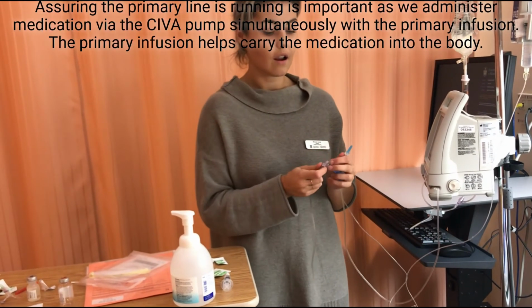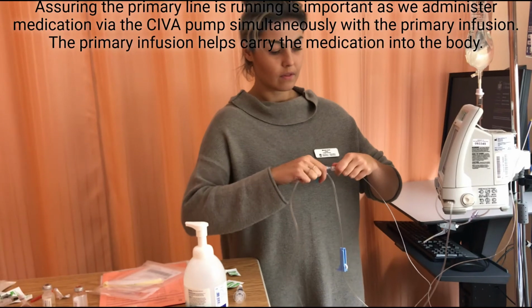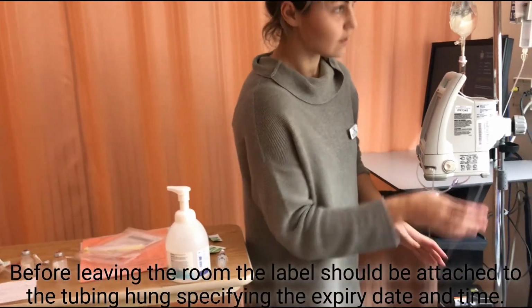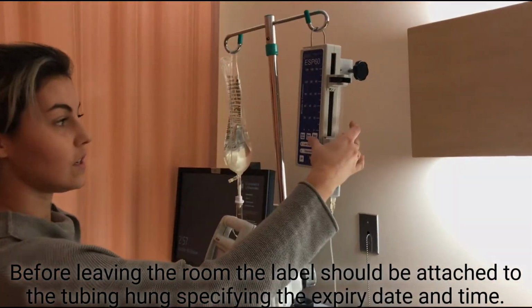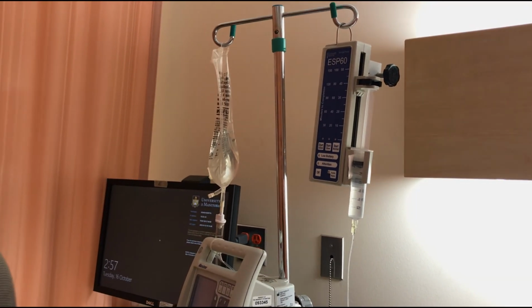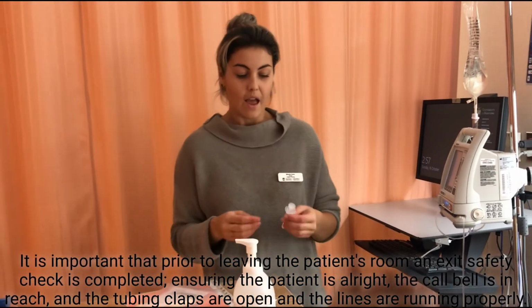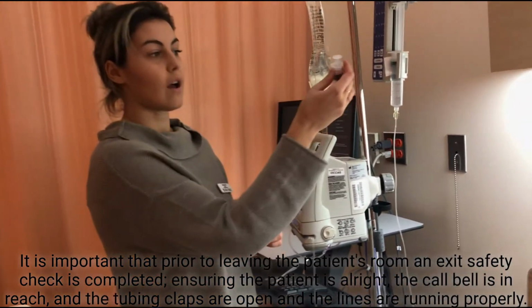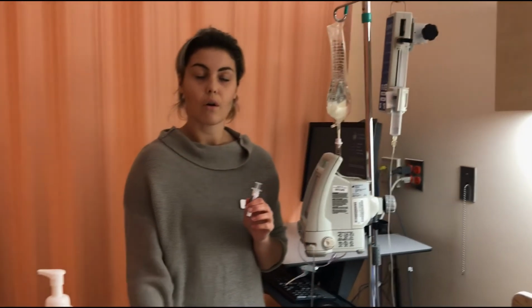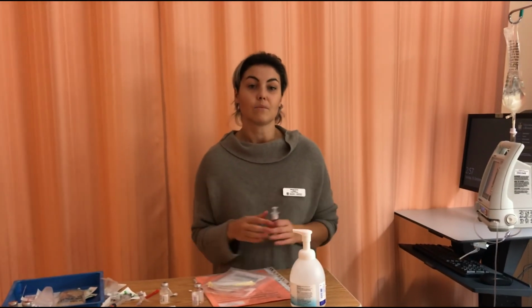So 30 seconds again there, and 15 seconds to dry. Attaching this here and pressing start. Seeing the green light flashing ensures that it's running, and then after it's finished infusing, I will come back. So after the 35 minutes, I will flush the line with a 3 ml syringe of normal saline at the same rate, just to clear the line to ensure no medication is missed. And then at the end, I will just document that I gave the medication.